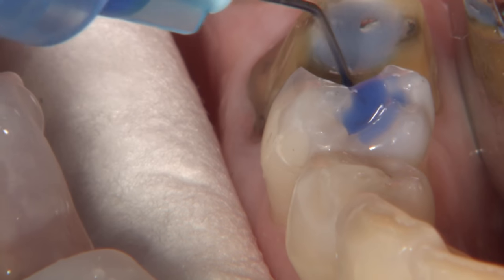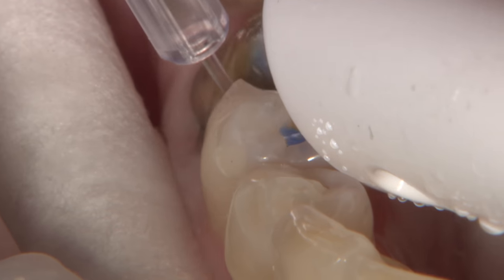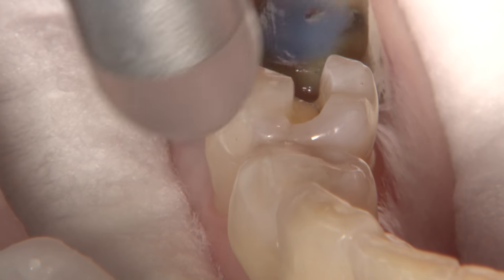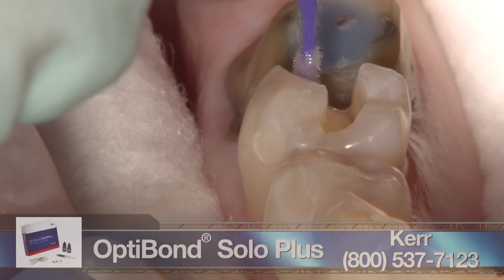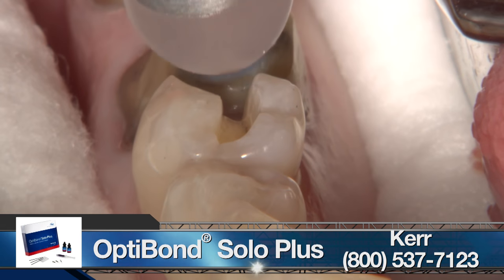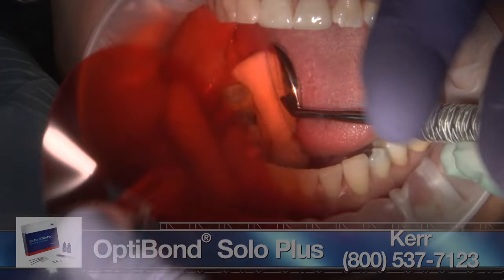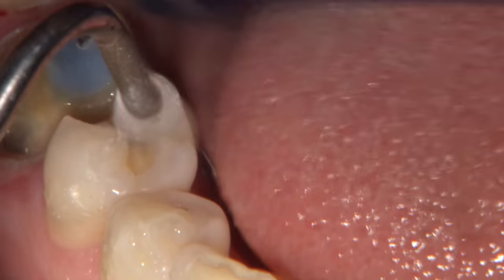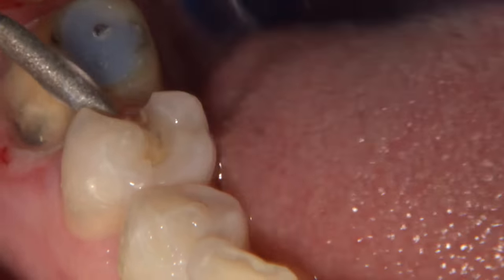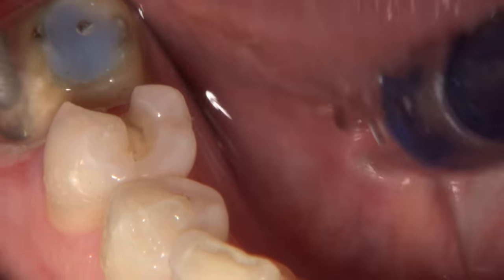To seal the exposed dentin, I apply acid etch using 35% phosphoric acid, rinse and dry, and then apply a generous layer of OptiBond adhesive resin and polymerize. I use 10-second increments since it is a vital tooth. This will allow for cooling without damaging the pulp. With a Cavitron or a fine diamond burr, at a slow speed, we can remove the adhesive from the enamel and define the enamel margin before taking the final impression.